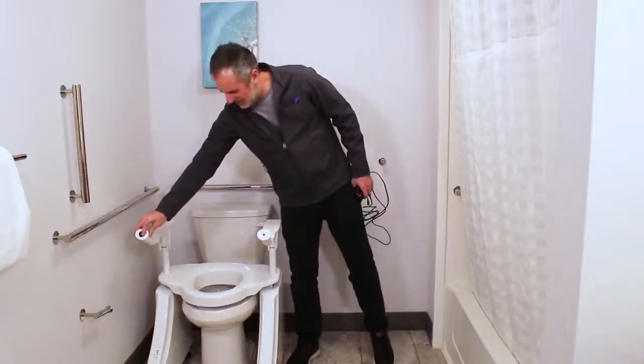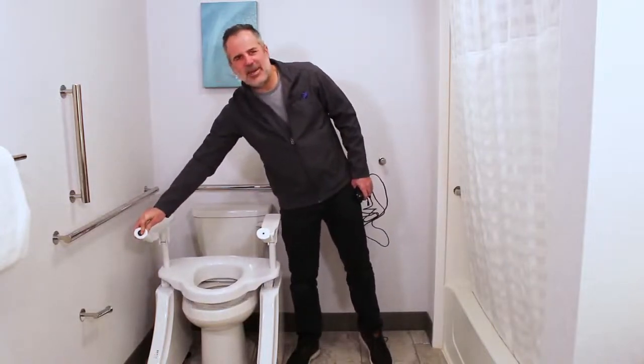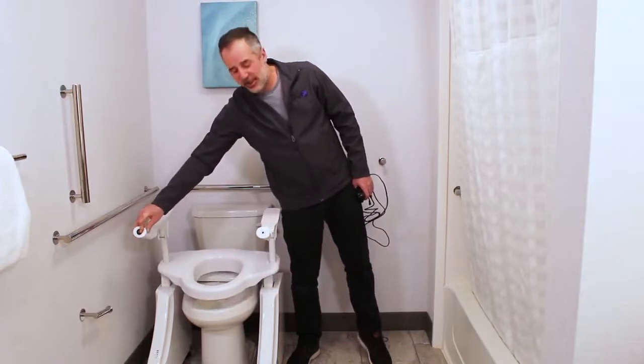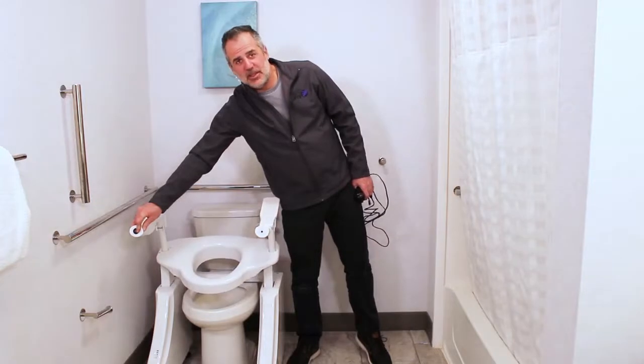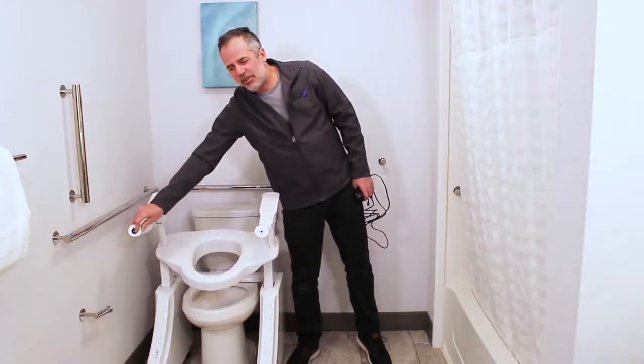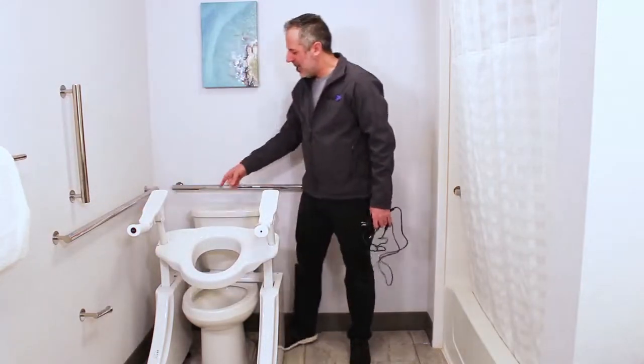I'll show you how. Lift the lift — most of the time you'll have the lift in the upright position anyway because you just got up or it's waiting for you to sit down. So when the lift is in the upright position, the battery is back in this right corner.